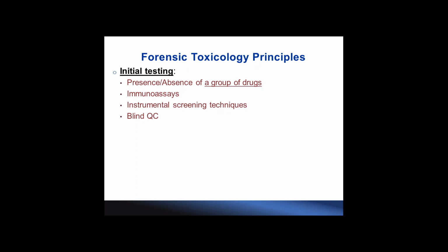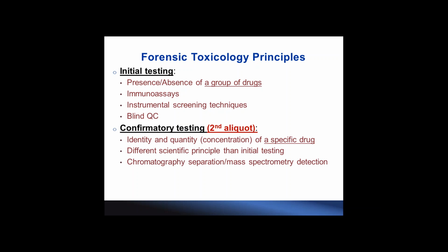And when we confirm it, we go through the same analytical process. It's just that there is an extra ion transition that will add the extra layer of confirmation to the same technique. So in our mind, this can be considered as a compromised, different scientific principle, in a sense, in order to follow the principle.